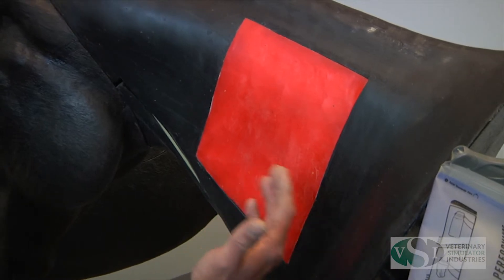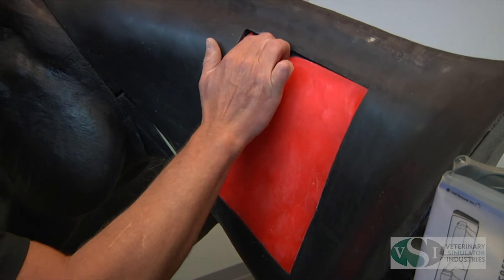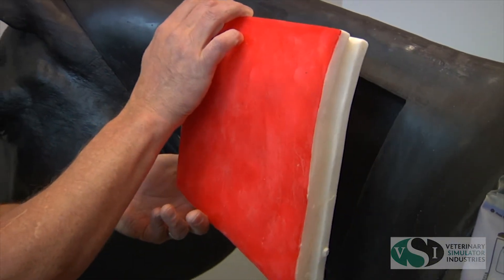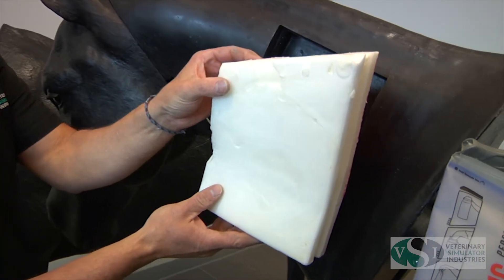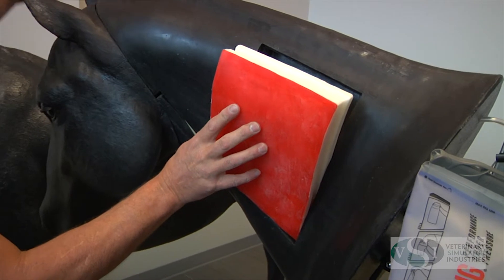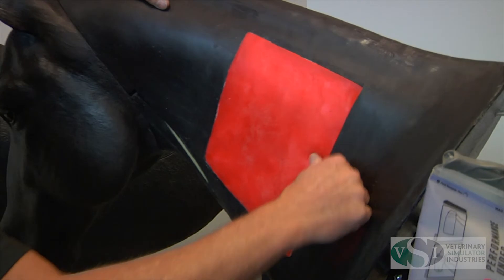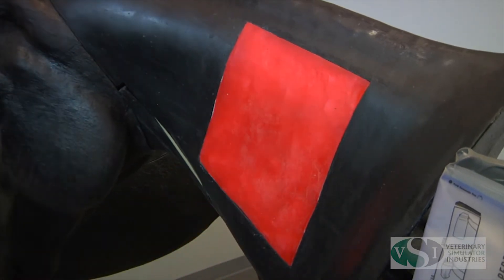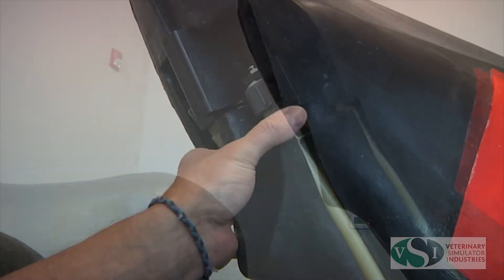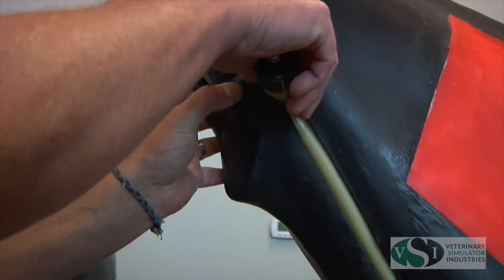The IM pads are replaceable items which are easily removed as shown. To remove the venipuncture tubing, first remove the equine head. Gently pull the vein tubing away from the silicone vein backer.